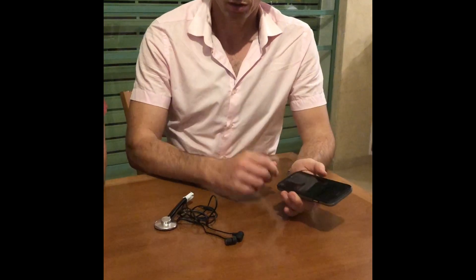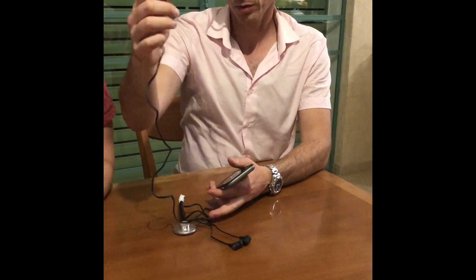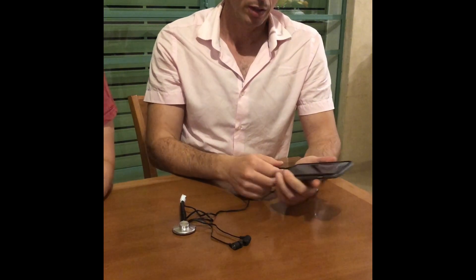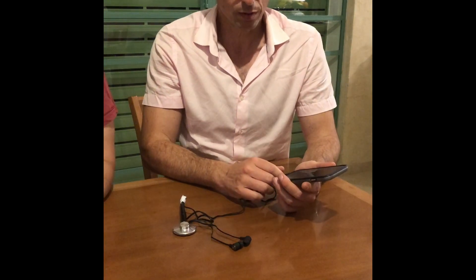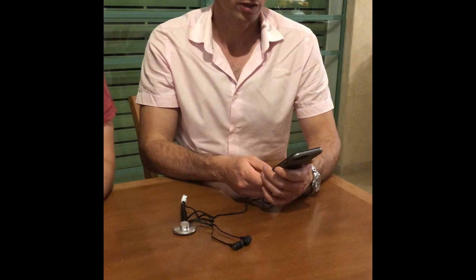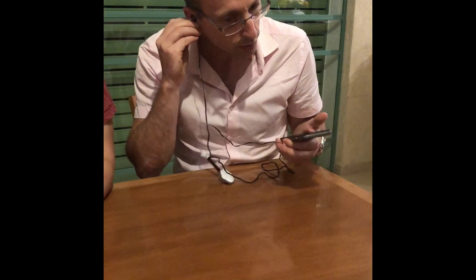Now we come to the usage of the remote stethoscope. It's very straightforward — you just need to plug the earphones into the earphone jack. If you don't have an earphone jack, like in the new iPhones, you can use an adapter. Next, we make a WhatsApp video call to the doctor.